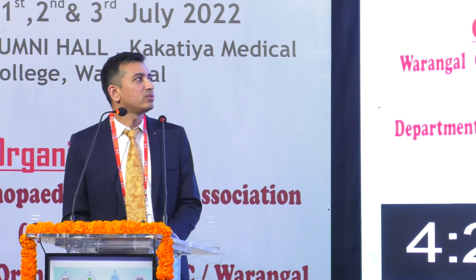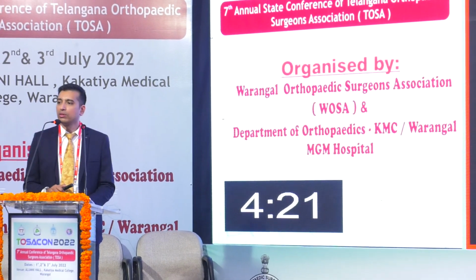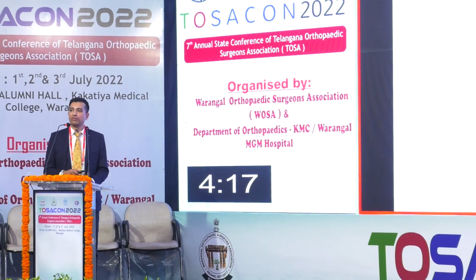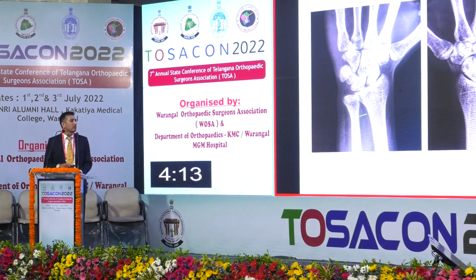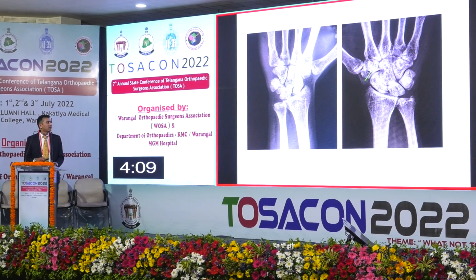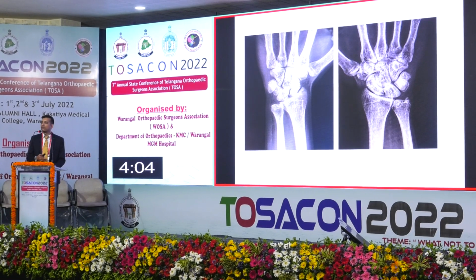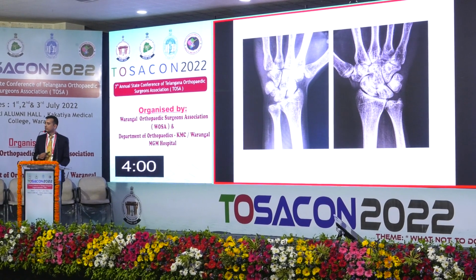Similarly, coming to wrist injuries, always confusion arises whether to take AP view or a PA view. So never take an AP view, because a clear-cut diagnosis cannot be established with the AP view in wrist injury. Always a PA view. But how do you know? Some patient has come to us with two X-rays like this. How do you clearly make out which one is AP and which one is PA? Anybody from the PGs can answer which one is AP and which one is PA?